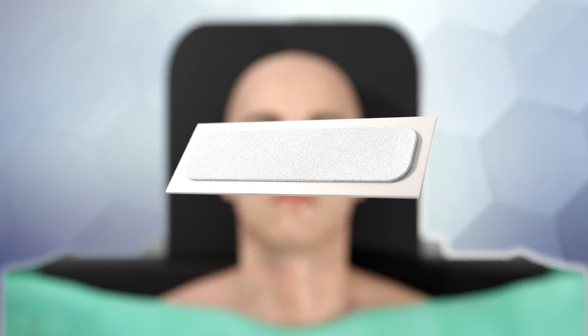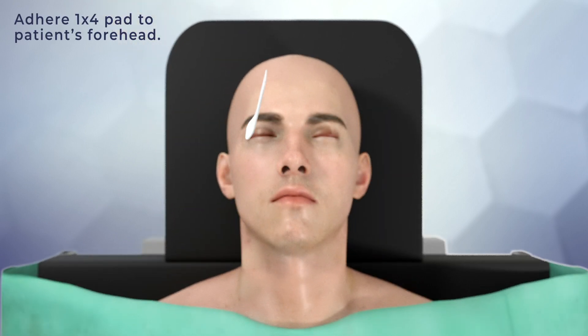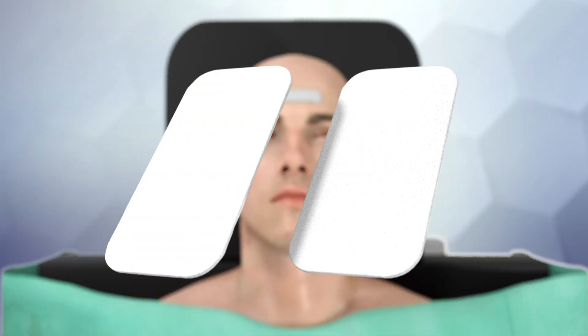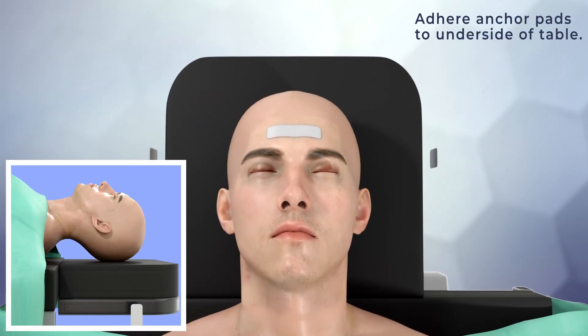Remove the adhesive backing to expose the adhesive from the 1x4 pad and adhere it to the middle of the patient's forehead, just above the eyebrows. Remove the backing from the remaining two anchor pads and adhere them on the left and right of the underside of the table, ensuring that they are aligned parallel to the pad on the patient's head.